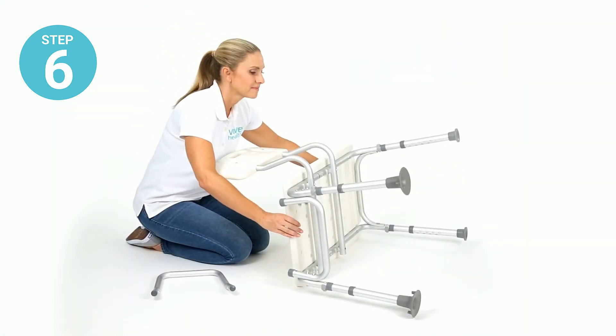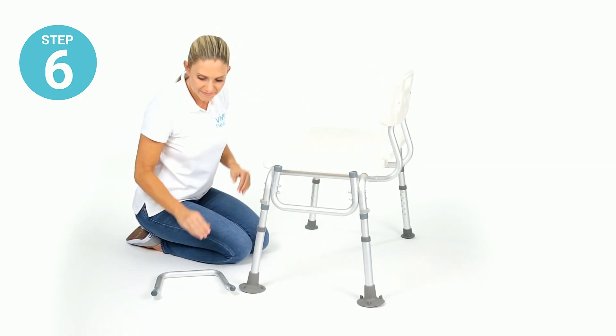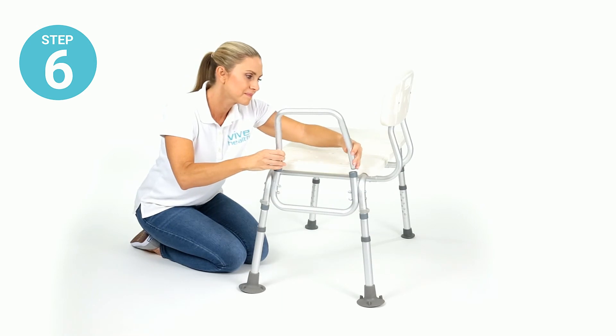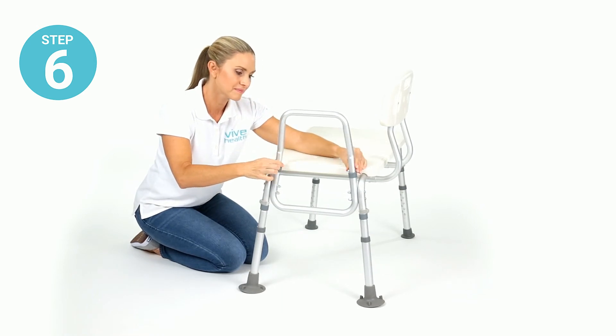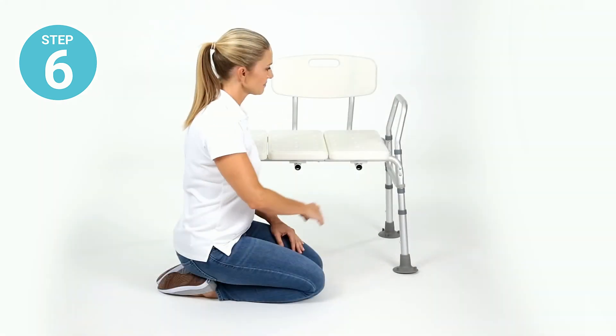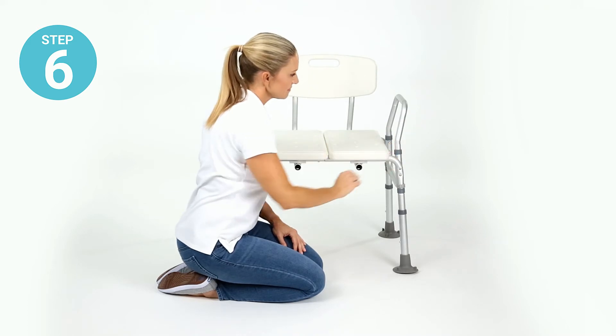Step six: stand the bench up on its four feet and attach the armrest by depressing the locking pins and fitting the bar into the sockets on one side of the bench. Make sure the armrest bar curves out and away from the seat.